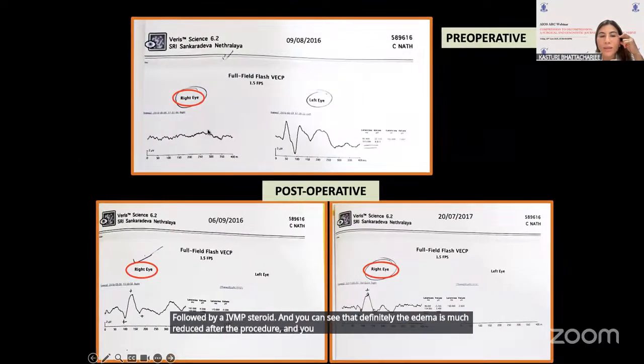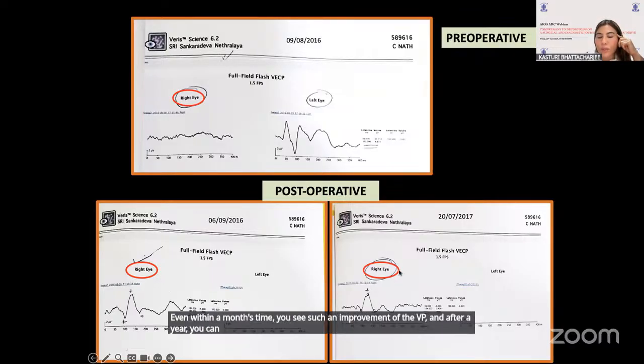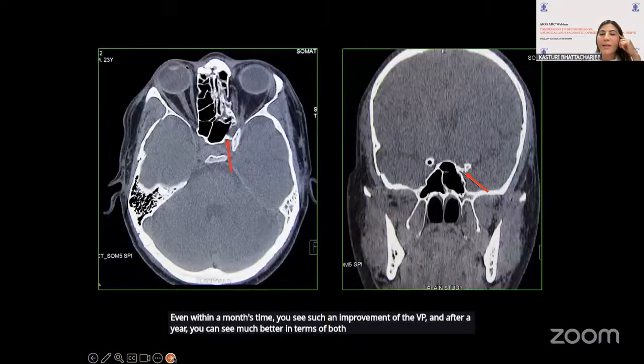And you can see here how this improvement of the VEP, this is just before the procedure. Even within a month's time, you see such an improvement of the VEP. And after a year, you can see much better results in terms of both the latency and the amplitude.